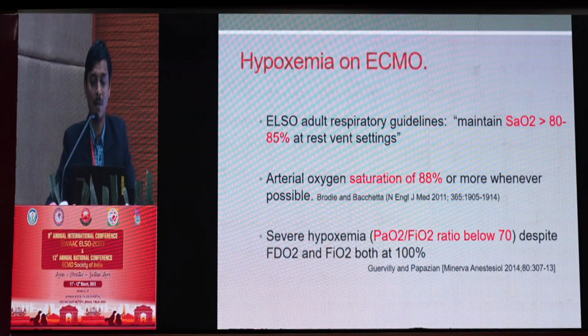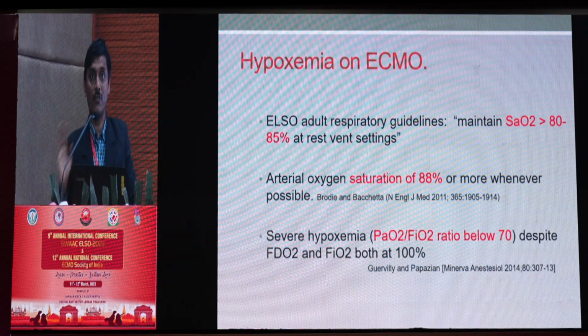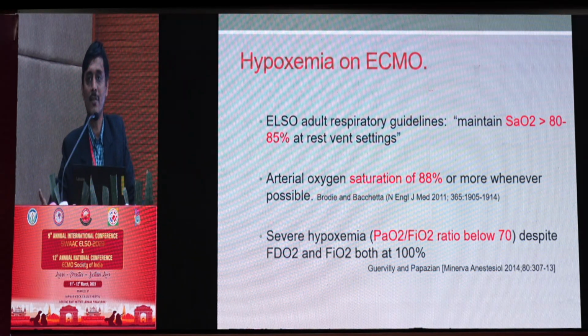on ECMO. And of course, as with the ELSO definitions, there are other institutional protocols that define refractory hypoxemia on ECMO differently too. So the point I'm trying to make here is there is some blurriness about what refractoriness is and what low PO2s you can accept.